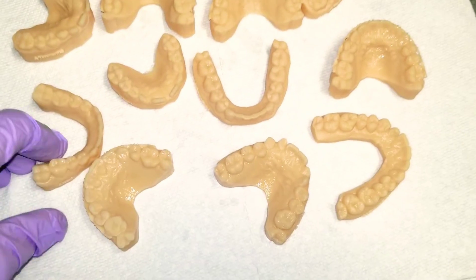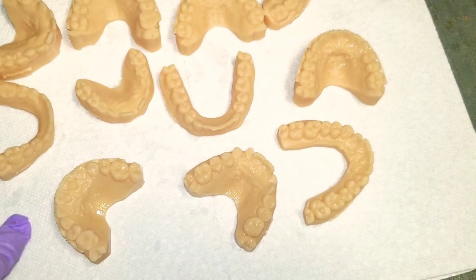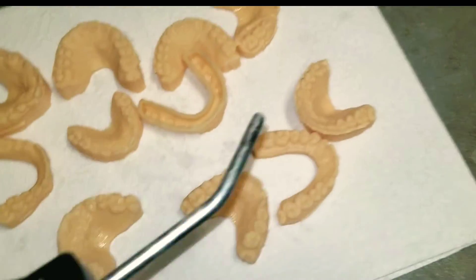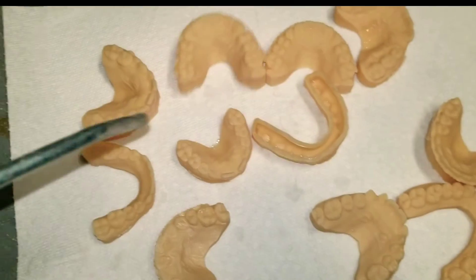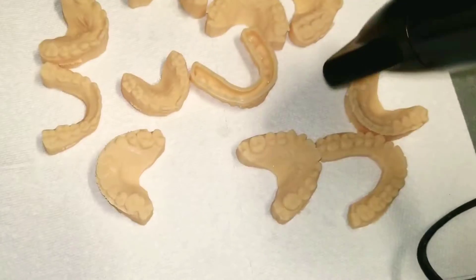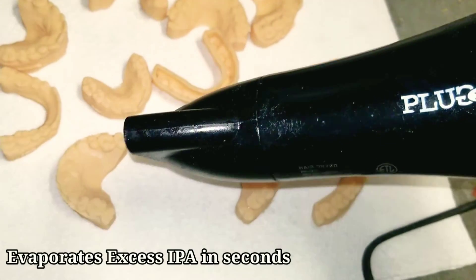I remove all the models and place them on a paper towel and now I'm going to give them a quick dry. There are two ways of doing this: you can use an air hose, or you can do what I do — I use a low heat hair dryer.